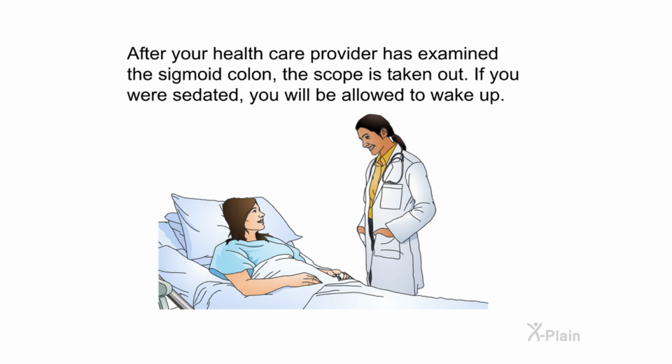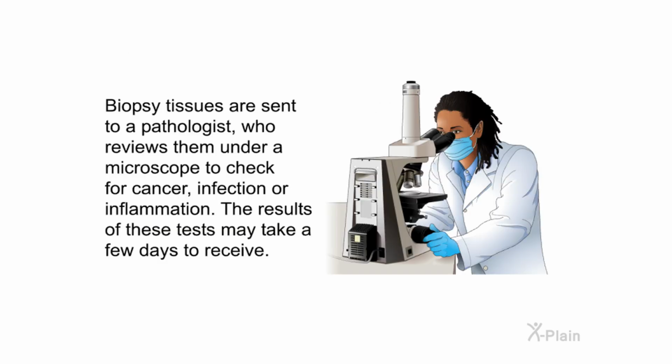After your healthcare provider has examined the sigmoid colon, the scope is taken out. If you were sedated, you will be allowed to wake up. Biopsy tissues are sent to a pathologist who reviews them under a microscope to check for cancer, infection, or inflammation. The results of these tests may take a few days to receive.